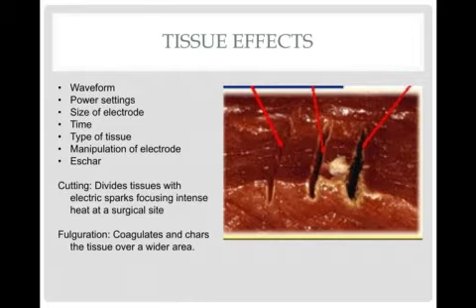We said before that some waveforms work better as contact and some as non-contact diathermy.